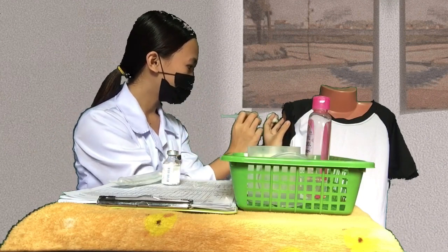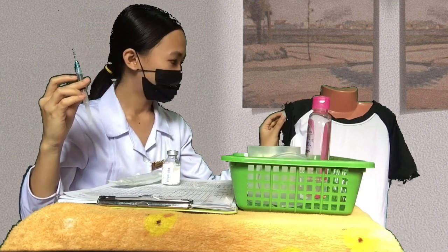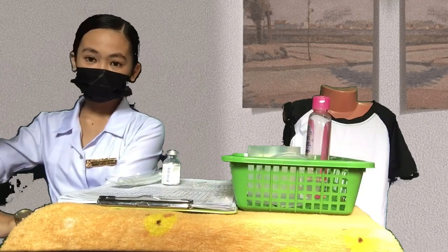Okay, then next is I'm going to locate the site and administer the medication. So assuming that I have already administered the medication, I'm going to put the cotton ball there and leave it for a few seconds. And then after that, I'm going to discard the cotton ball and recap using the scoop method, and then we're going to dispose of it in the sharps container. It is to prevent induration.